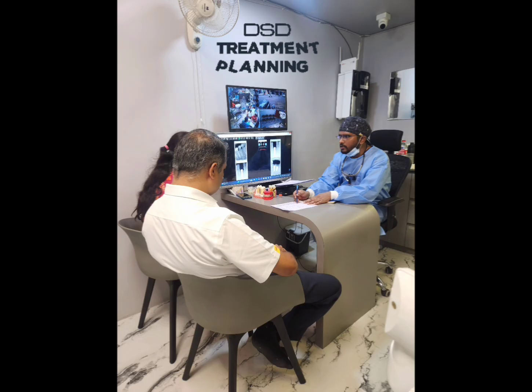Treatment planning. Our treatment plan included atraumatic extraction of tooth number 24, thorough debridement and curettage of the infected socket, irrigation with saline mixed with tetracycline for disinfection, immediate implant placement, guided bone regeneration using a combination of autogenous bone and allograft, coverage with a collagen membrane, and primary tension-free closure.